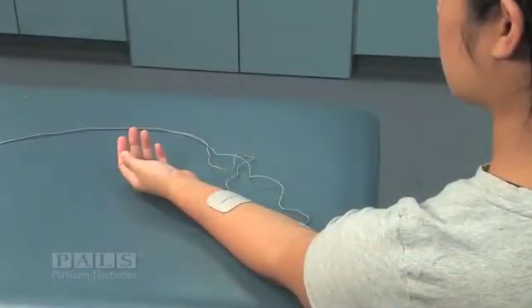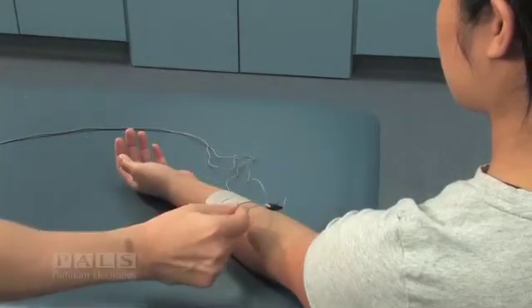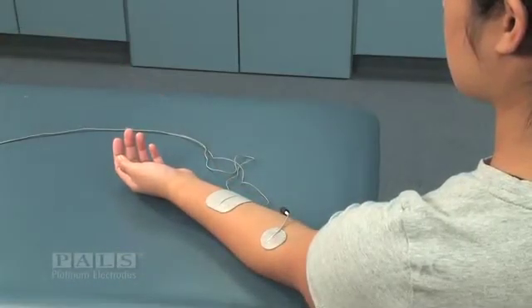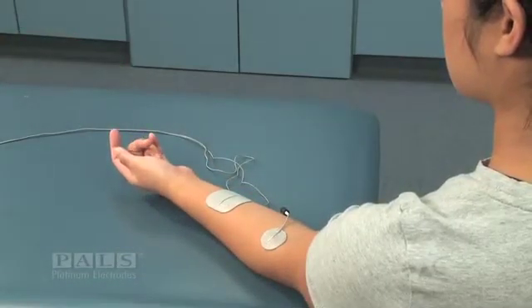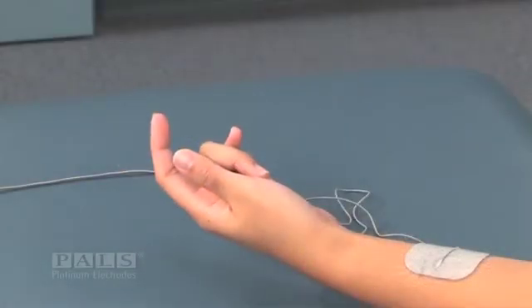When the negative electrode is moved one centimeter radially from its optimal location, you see an increase in finger flexion and compromised wrist flexion.